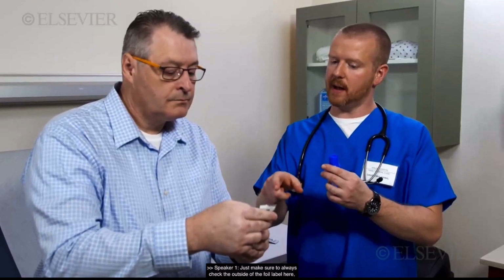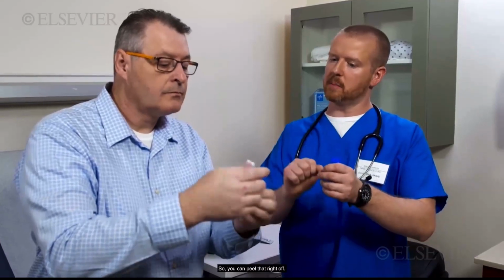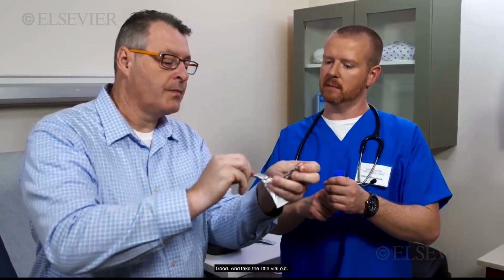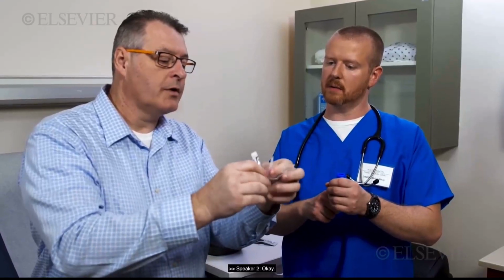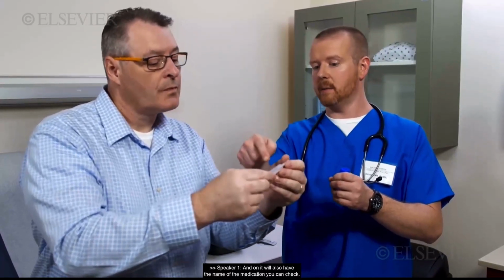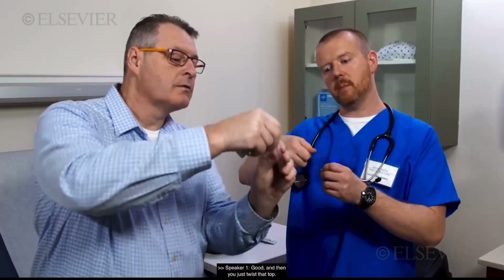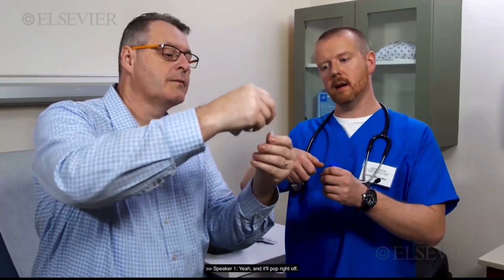I'm going to teach you how to put your medication in at home if you're doing your nebulizer. Here's the medication. Just make sure to always check the outside of the foil label here, just to know you have the right medication, right dosage. It'll twist right there in the top, so you can peel that out. Like this? Yeah, it should tear. Good. And take the little vial out. And on it will also have the name of the medication that you can check. And then you just twist that top. Like that? Yeah, and it'll pop right off.